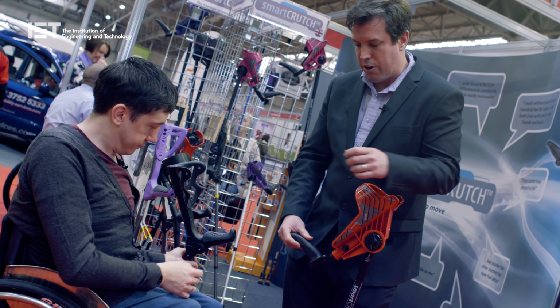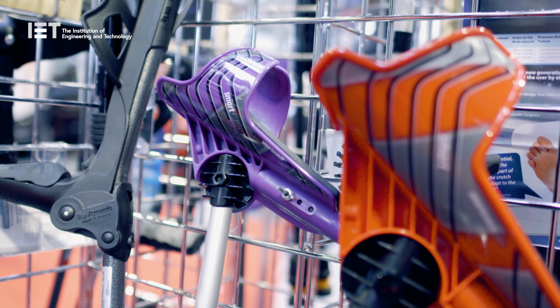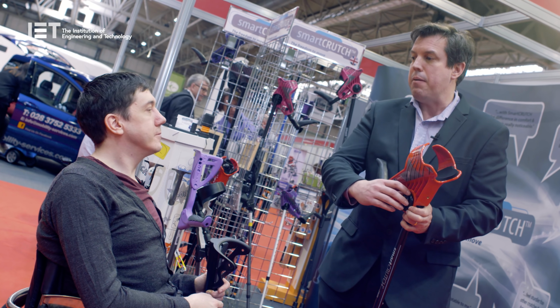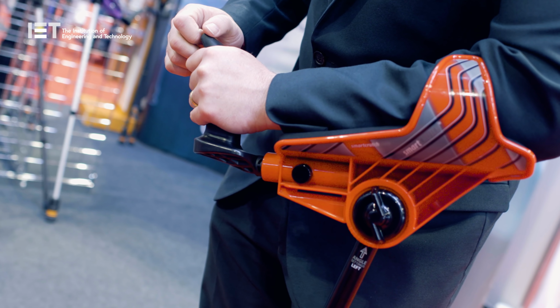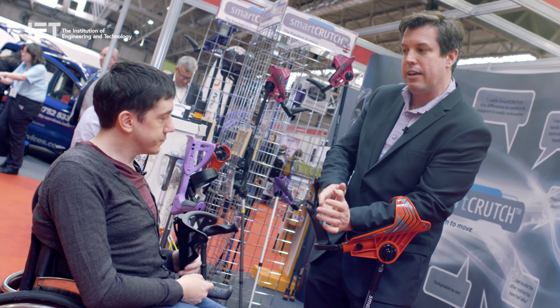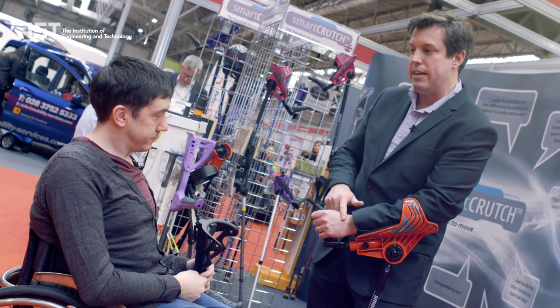So we have the smart crutch, and this takes it to a different level in that it's angle adjustable. Changing the angle means that you're taking the pressure away from your wrist and placing that into the fatter part of your forearm. Brilliant. And that obviously spreads the weight, but also noticeably your wrist is straight at that stage. In other words, you're not bending it, creating that damage. So even if you have it in a lower angle, your wrist is still straight.